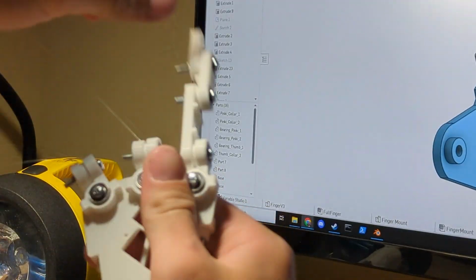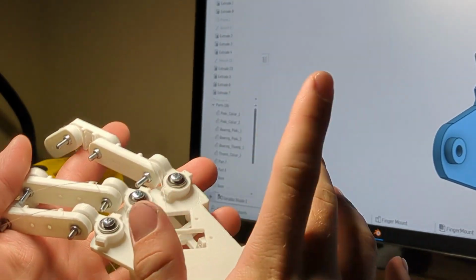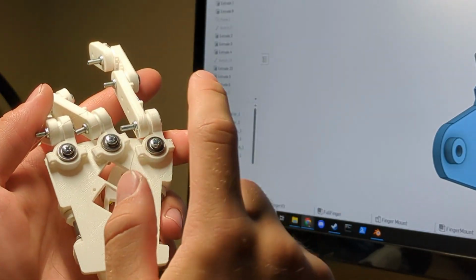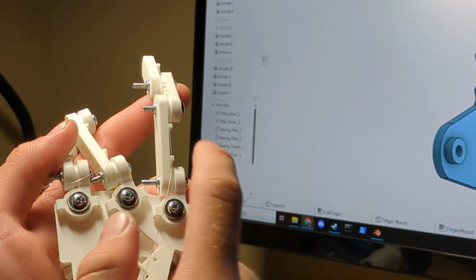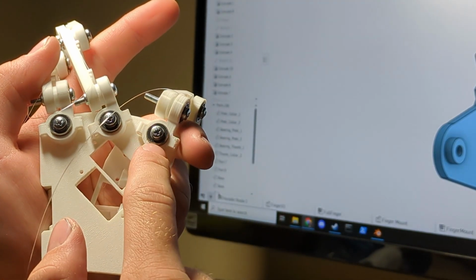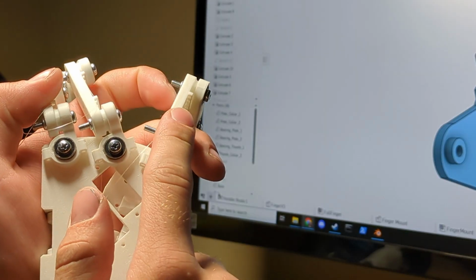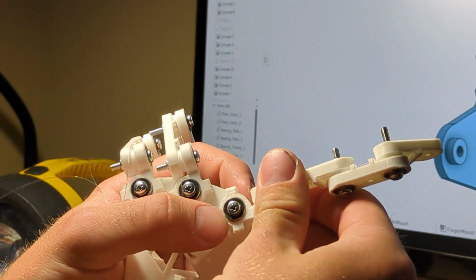So to fix that, I'm gonna have to restructure the fingers. I think it's actually gonna look significantly better. So they'll look much more like knuckles. It'll make better wire routing, but essentially these bearings here, I have to rotate 90 degrees so that this folding knuckle part actually happens where it's attached to the hand, and the splaying joint is attached to the finger. So it's just gonna be a flip. That's a refactor of the 3D model.